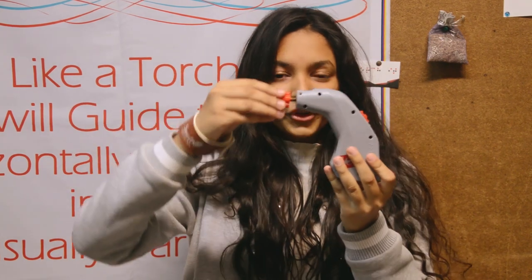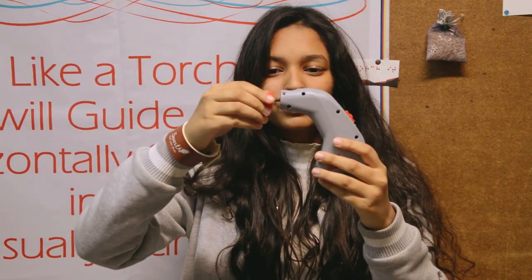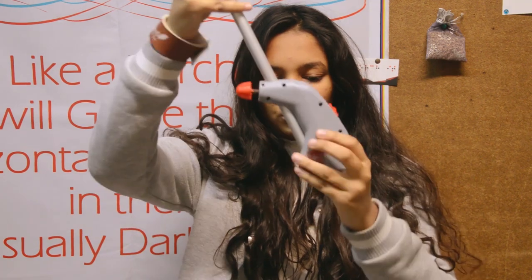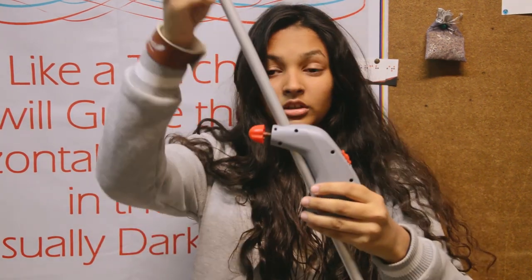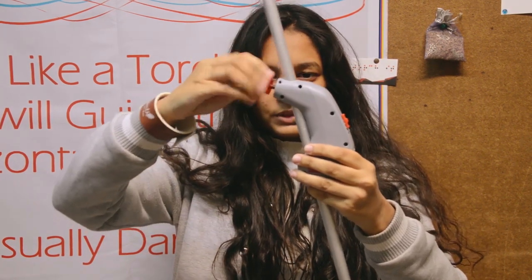As you move your hand further backwards, you will find a knob and a hole. Unscrew the knob gently and put your cane through the hole — through the second hole which has been given here. Put it in as much as is required and tighten the knob subsequently.